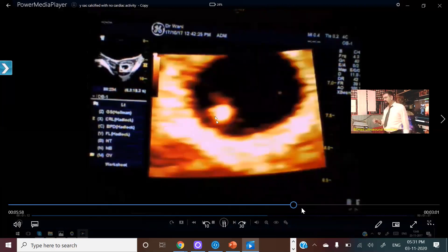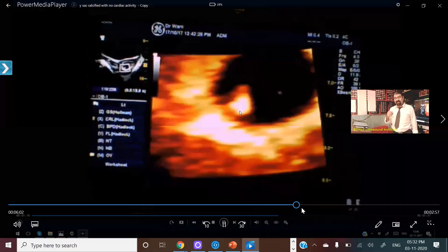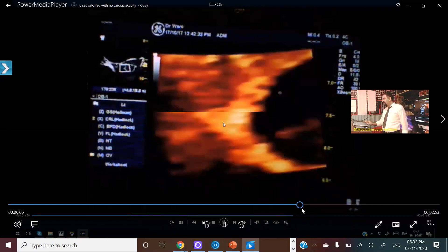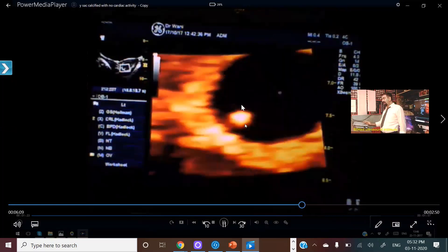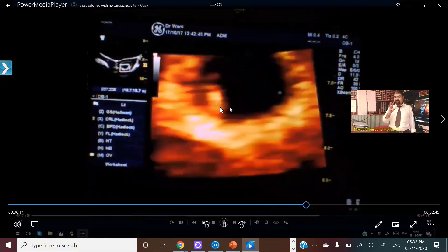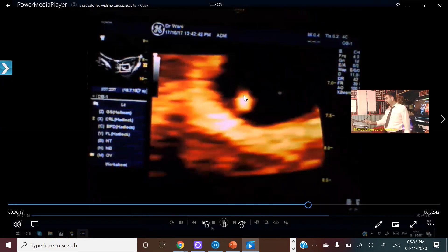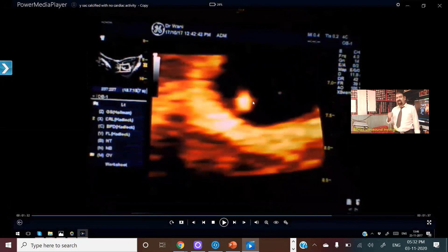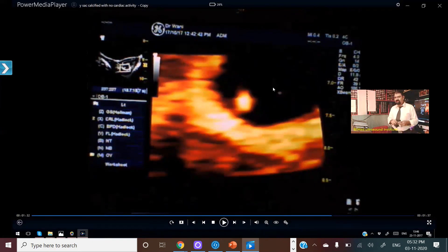And if I am seeing a yolk sac and that yolk sac is calcified, again going in favor of an abnormal pregnancy. This is the importance of scanning the yolk sac. What I am seeing over here is a very dense calcified yolk sac — very dense calcified. Due to this calcified yolk sac, I am not able to see the fetal pulsation. So I can say it is a missed abortion and this is a dead fetus already.